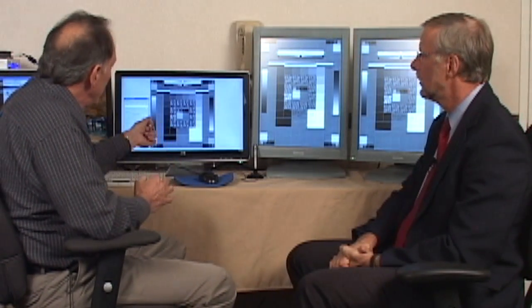Now, how would I calibrate a monitor? Let's say I go buy an off-the-shelf commercial grade monitor, are there any tools that you would recommend that people can use to calibrate these? Yeah, you can do it in a software-only approach or a combination of software and hardware. This particular device I'm using is made by Real Vision. It's a little black box here that does electronically what is generally found within a medical display itself.